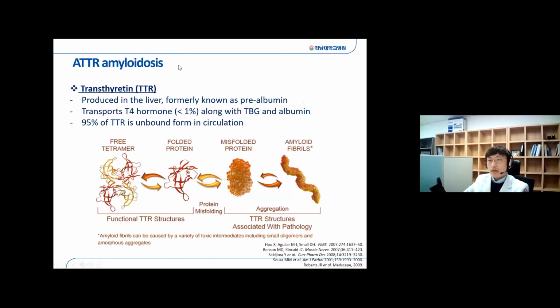Among them, transthyretin cardiac amyloidosis was the major target of nuclear imaging, and it has been recently integrated into clinical guidelines using bone scintigraphy for diagnosing this type of cardiac amyloidosis.